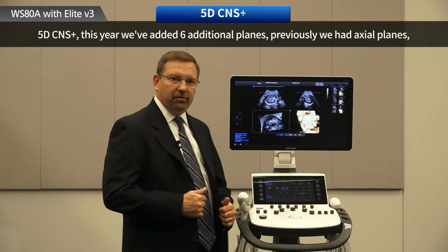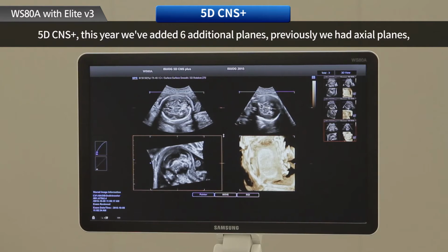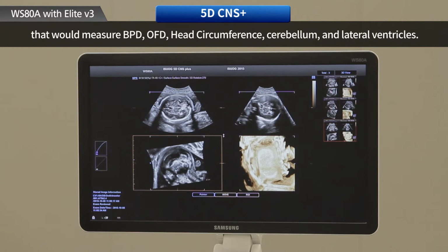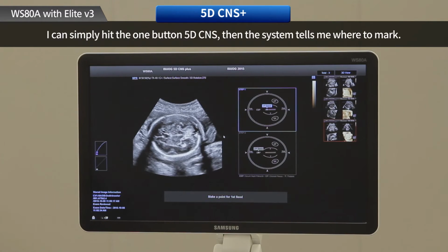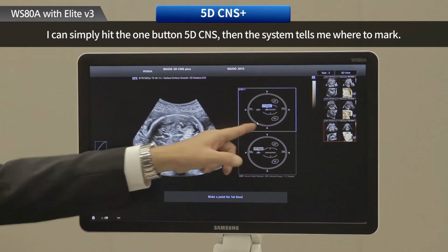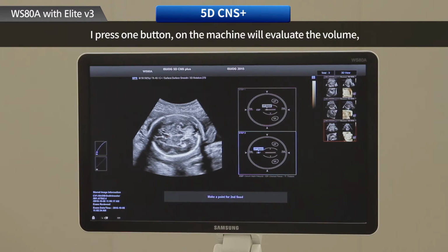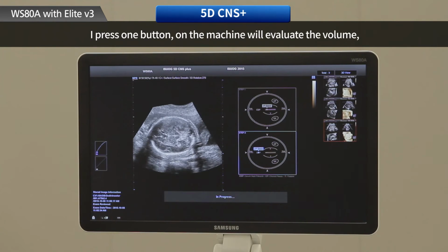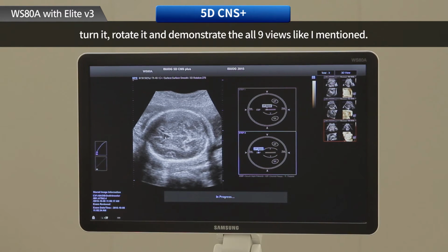5D CNS Plus. Again, this year we've added 6 additional planes. Previously we had the axial planes that would measure BPD, OFD, head circumference, cerebellum, and lateral ventricle. This technology is pretty amazing. I can simply hit the one button, 5D CNS. The system tells me where to mark, so I position my cursor between the thalamus, and I move my line through the cavum septum. I press one button. Now the machine will automatically evaluate the volume, turn it, rotate it, and demonstrate all 9 views, like I mentioned.